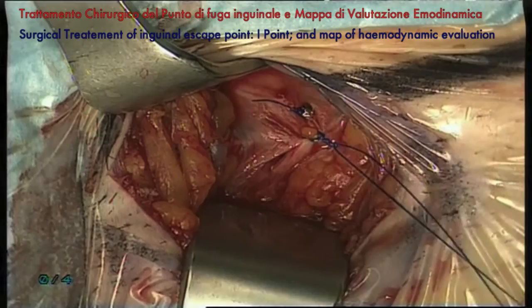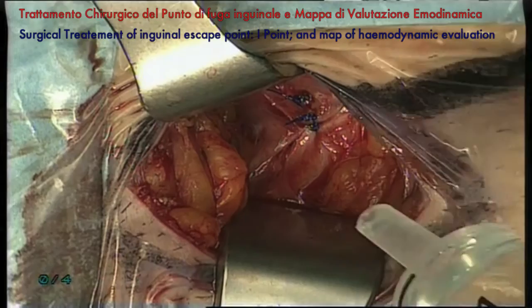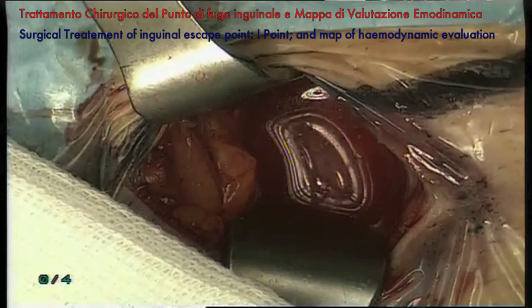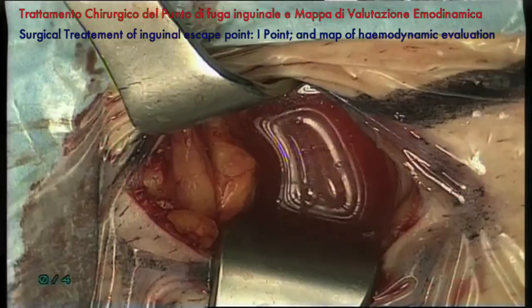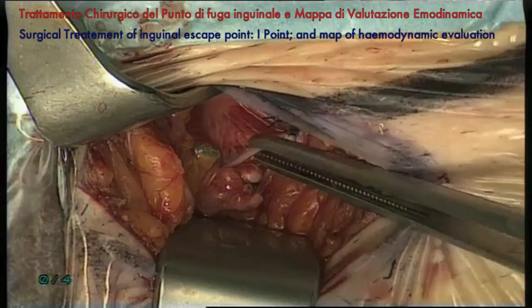Lavaggio con acqua, prima con acqua. Rinse with water. Signora, mi dà un colpo di tosse. Ancora? Lavaggio con soluzione di acqua e anestetico. This is a solution of water and some anesthesia. It's a slight rinse.